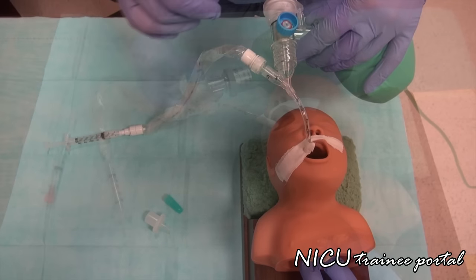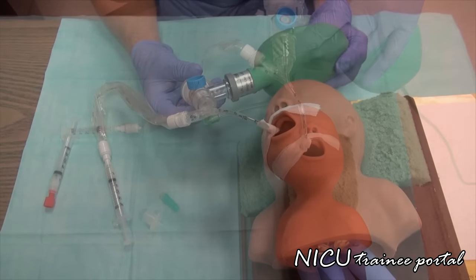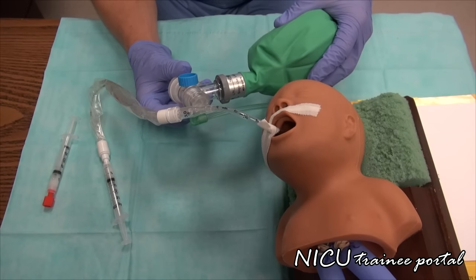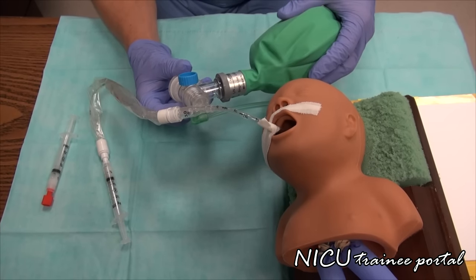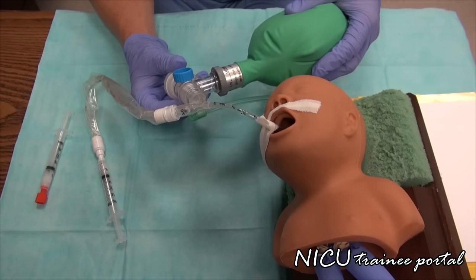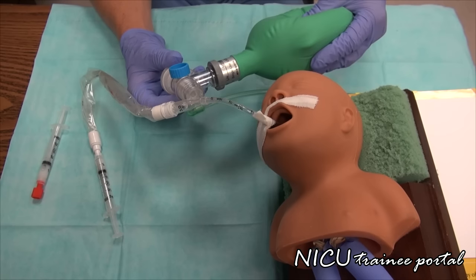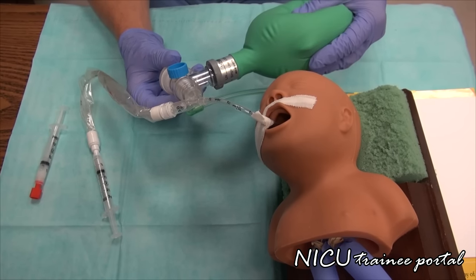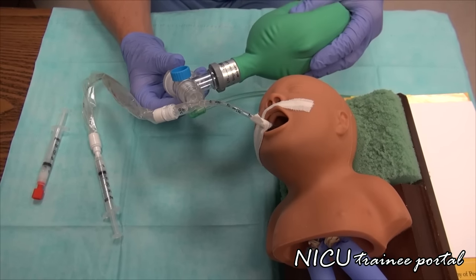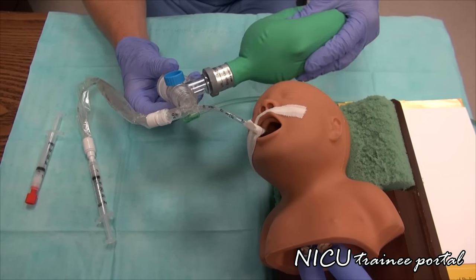We can also demonstrate giving both aliquots, tilting the baby to the right and to the left. Here we have the baby tilted on his or her right side and are about to give the first aliquot. Prior to administration of the first aliquot, things to consider: making sure the baby is stable, vital signs, saturation, and heart rate.